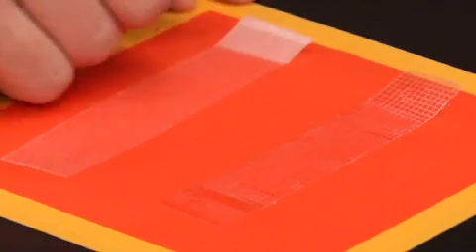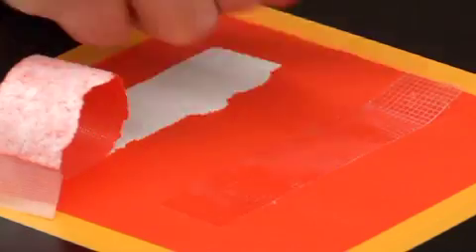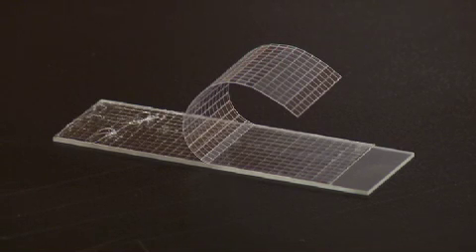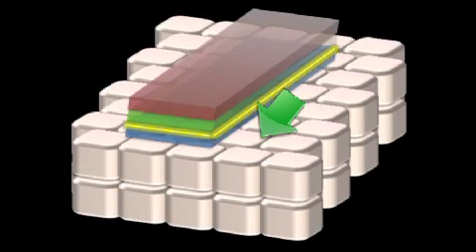Doctors Jeffrey Karp and Brian Lawlick of Brigham and Women's Hospital have a possible solution. That's a standard medical tape, and that's quick-release tape. Unlike regular medical tape, quick-release tape is made up of three layers. The stress of removing the tape is in the middle layer, not on the skin — so the hope is it won't cause any damage.